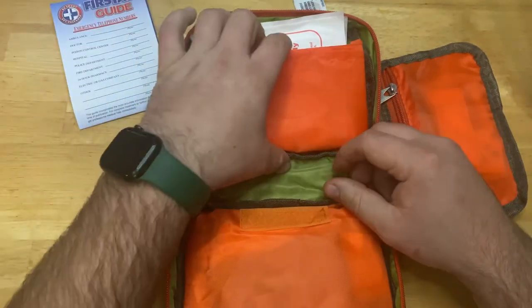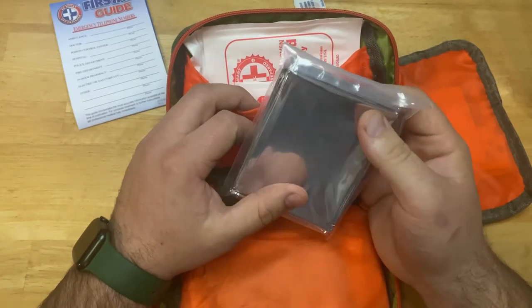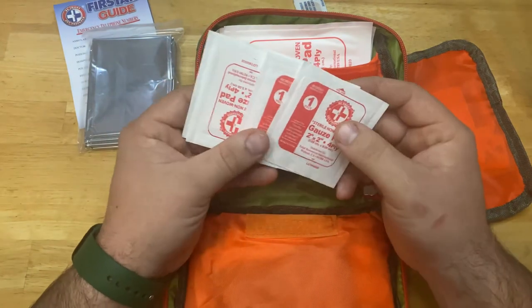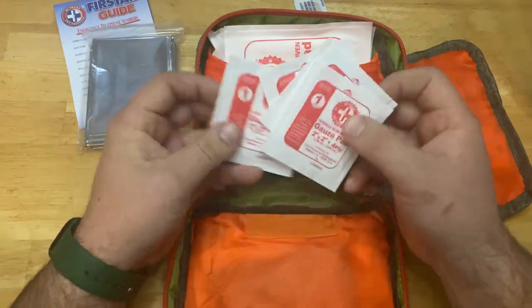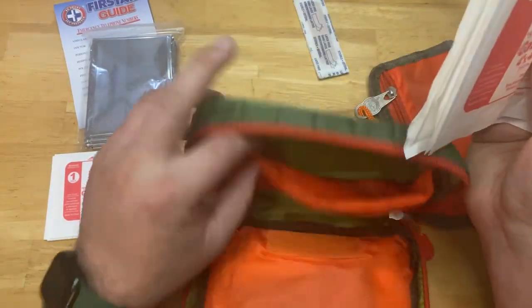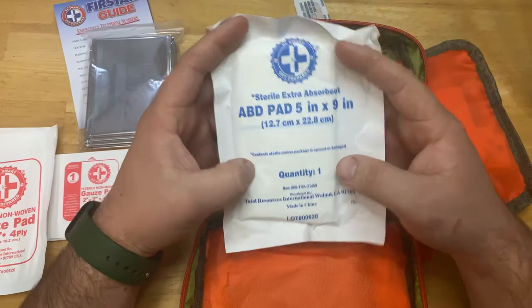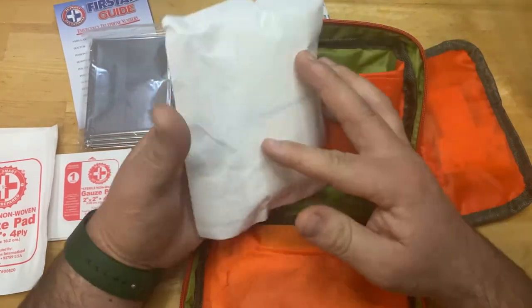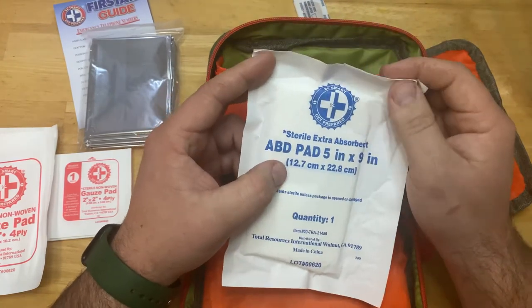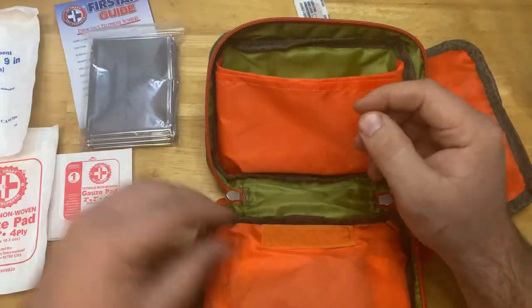Diving a little deeper into the kit: we have a survival blanket — it doesn't tell us how big it is; I threw away the wrapper. We've got a couple of small 2x2 gauzes for bleeding control, and then 4x4 gauzes — several of those. Then there's an ABD pad — abdominal pad, 5x9 inch, tri-folded inside. All you have to do is open it up and flip it out. This is really good for large volume bleeds.